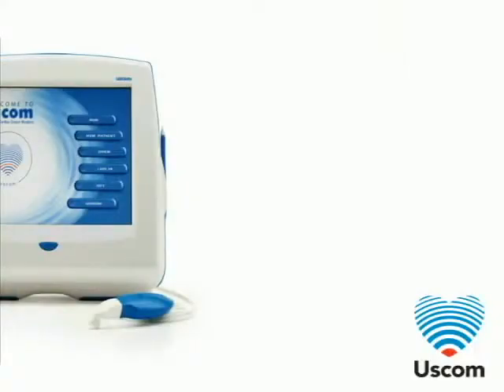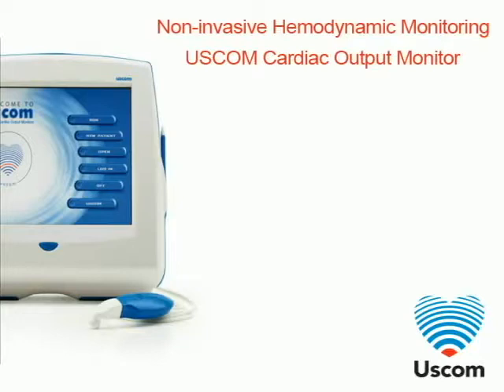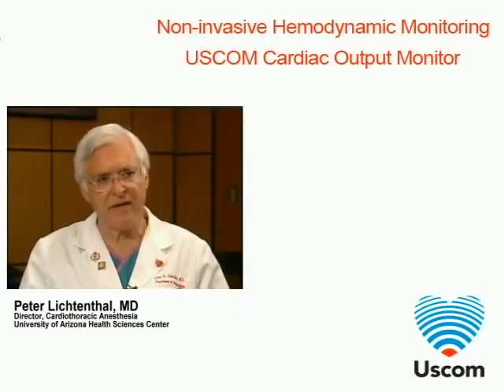It takes about 20 to 25 patients that you need to practice on to feel confident in your use of the device. And we actually have a published study that I gave you there that uses what's called the Fremantle protocol. And this is a group of emergency physicians that had no ultrasound experience. They wanted to see how long it took them to have less than 5% difference in measuring the same patient. And they found that it took approximately 20 patients to reach that point. Uscom is the only truly accurate non-invasive system.